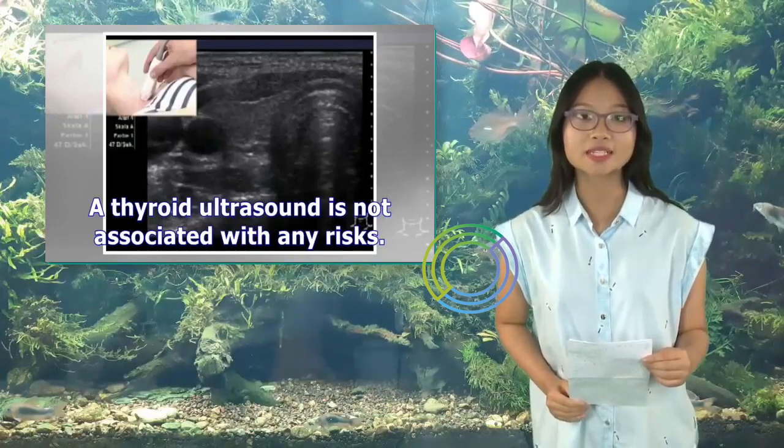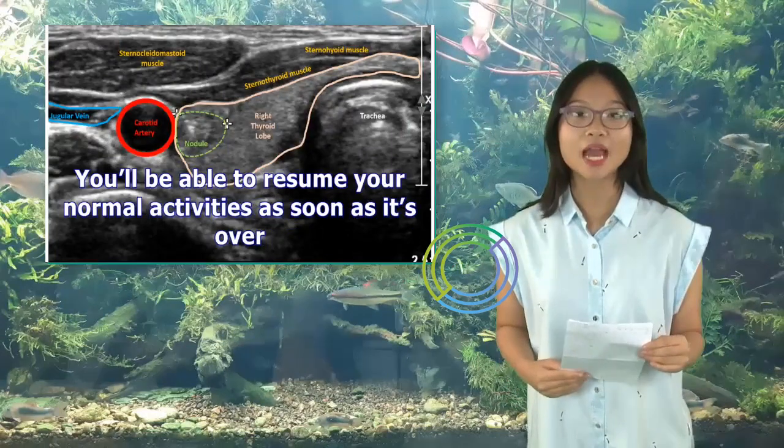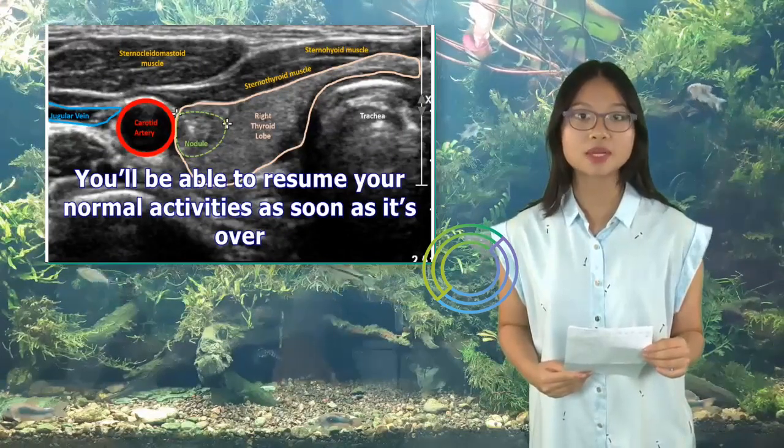A thyroid ultrasound is not associated with any risks. You'll be able to resume your normal activities as soon as it's over.